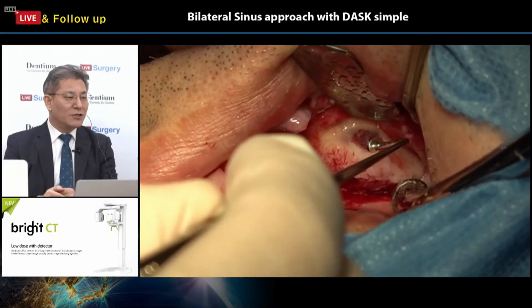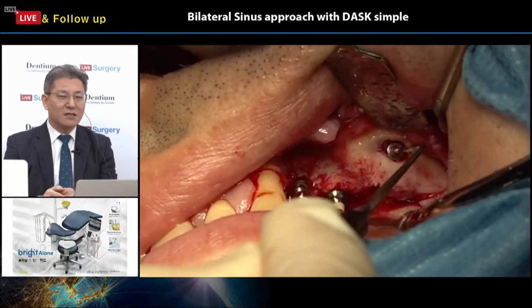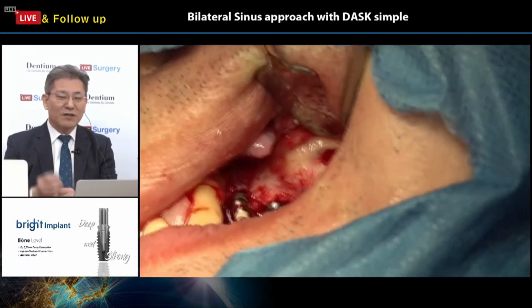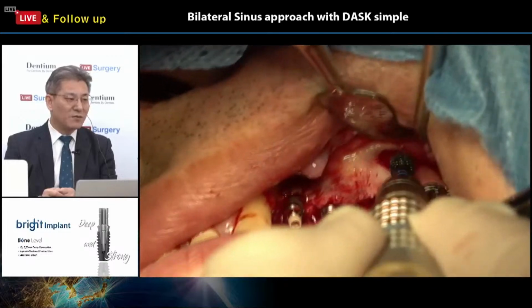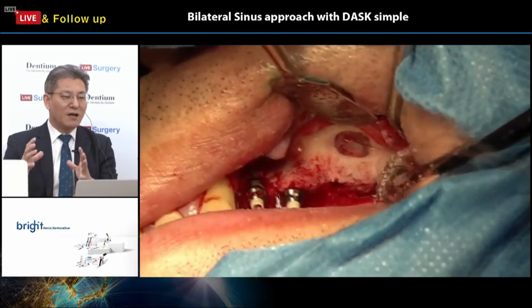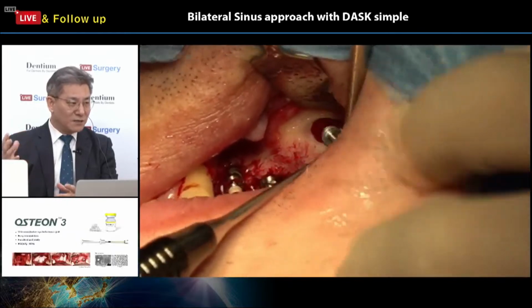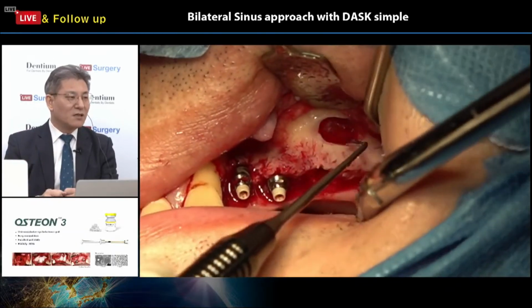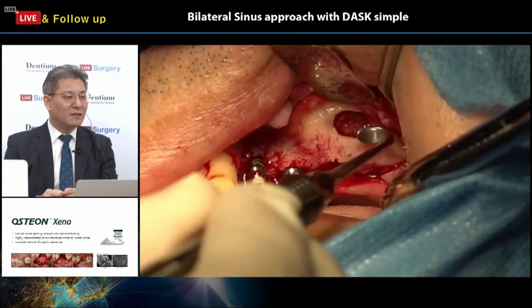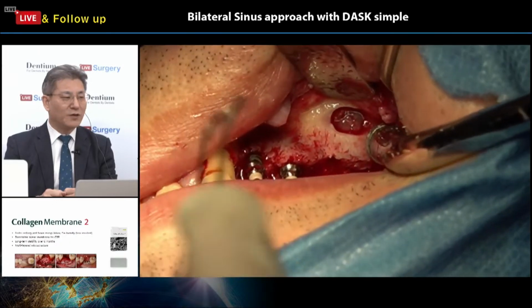Okay, so she is making the lateral window. Why? Because of the sinus perforation. When he had the crestal approach, maybe small sinus membrane perforations happened. Now, using this black diamond bar, which is faster and stronger, removing the lateral wall. And after that, they're using this sinus curette.